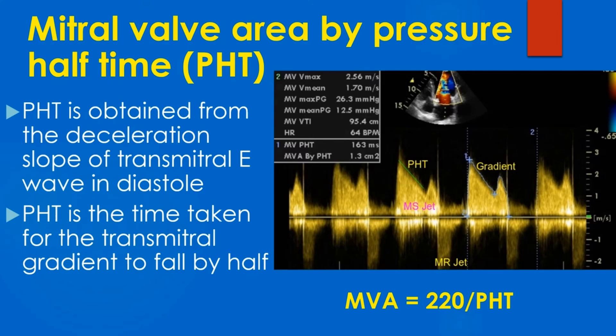A PHT of 220 ms corresponds to a mitral valve area of 1 square centimeter. Dividing 220 by the measured PHT gives the estimated mitral valve area. In this case, the PHT was 163 ms, giving an estimated mitral valve area by PHT of 1.3 square centimeters.